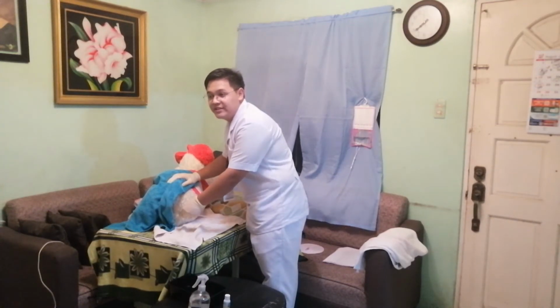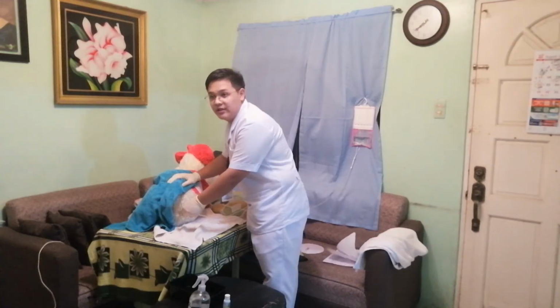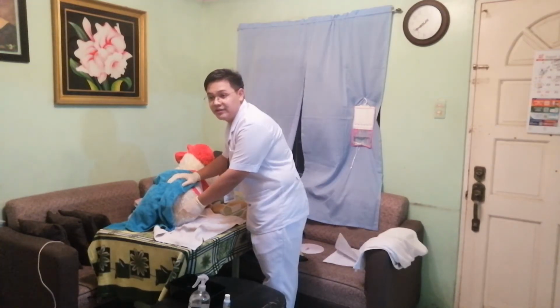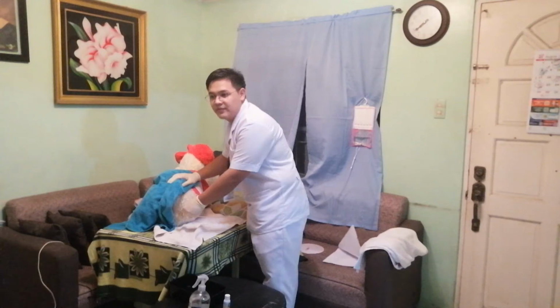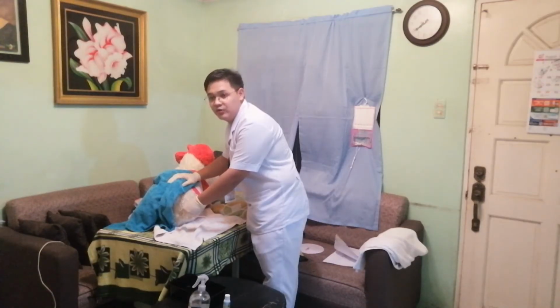For example, if we are using an enema bottle or a plastic commercial enema, we will need to roll it as we instill the solution.